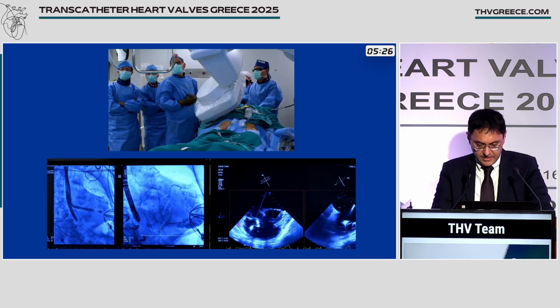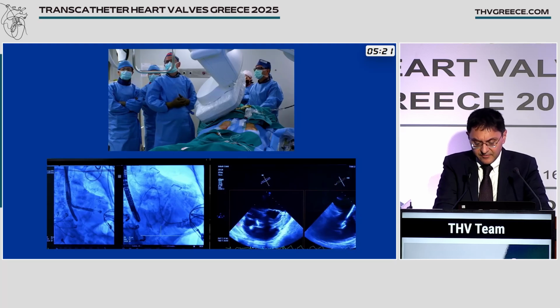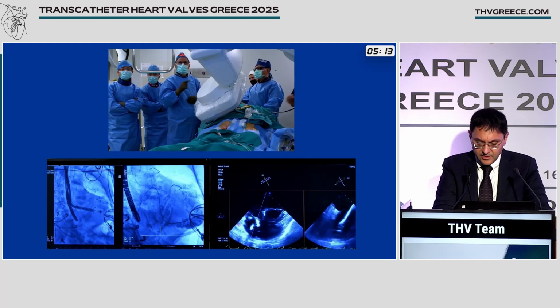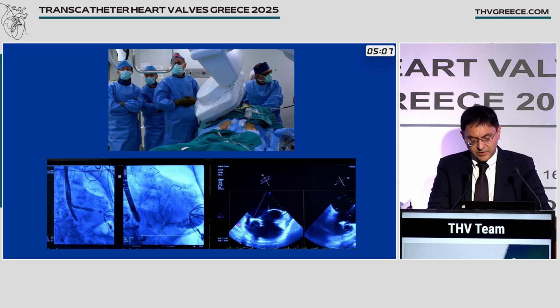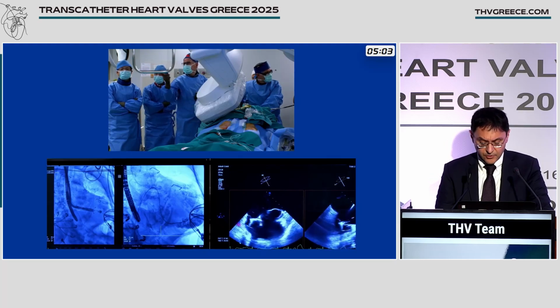So Dr. Chrissoheris is looking thoroughly through the valve. We have to be sure that we see leaflet above the graspers, the anterior and the posterior, before we can proceed with the next step. It is unsheathing the ventricular portion of the valve.